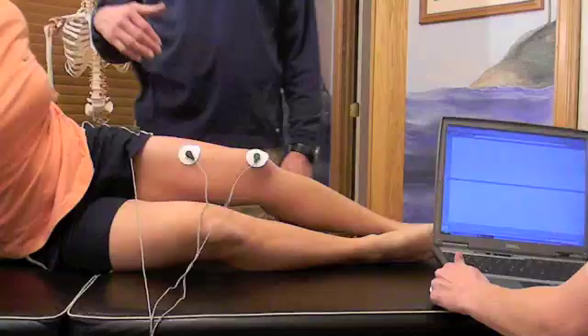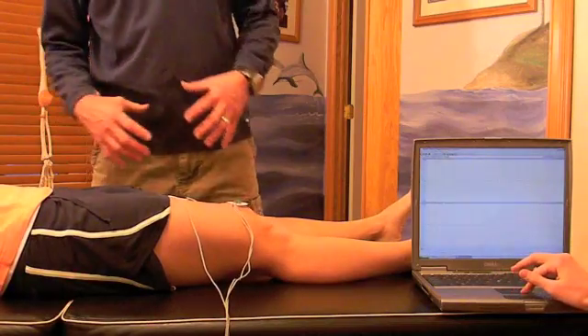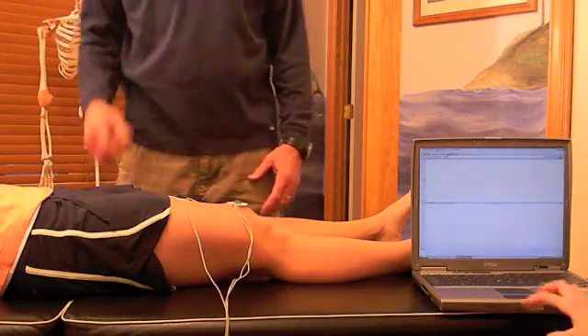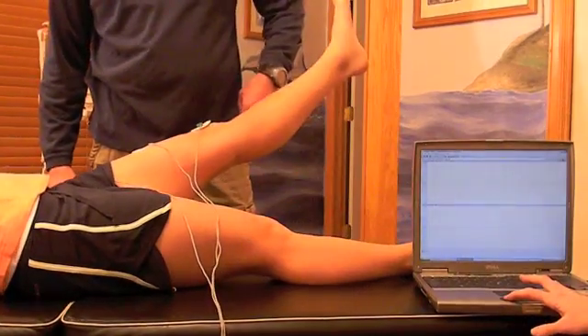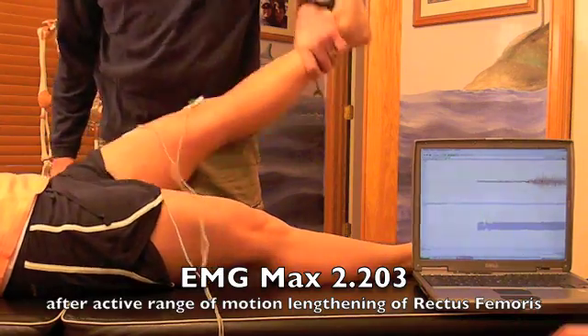We've done an active range stretch, only moving as far as her hip extensors can pull her leg back. Now we're going to do another rectus femoris test. Dana, go ahead and lift the leg. Hold it there. Ready — resist. Good.